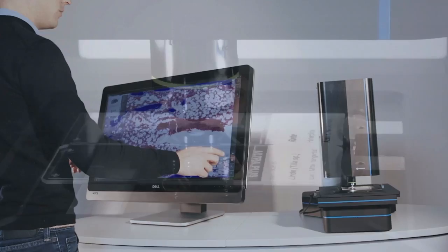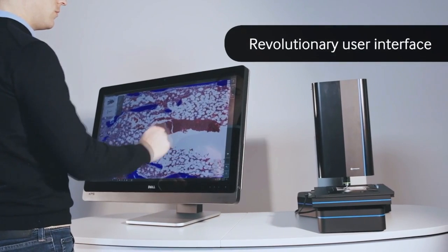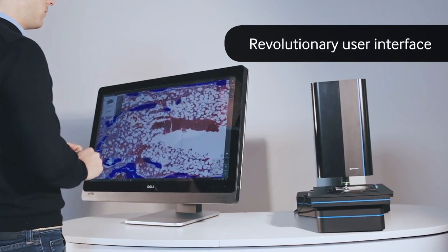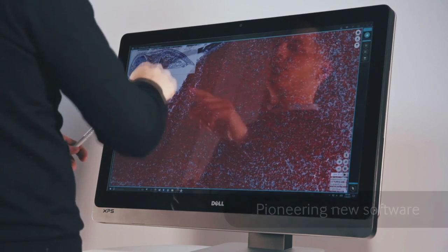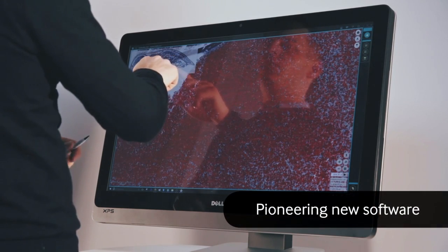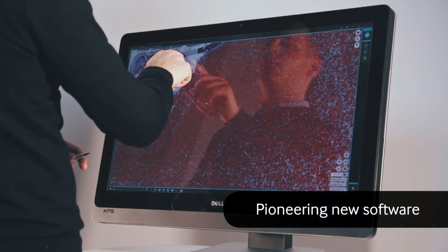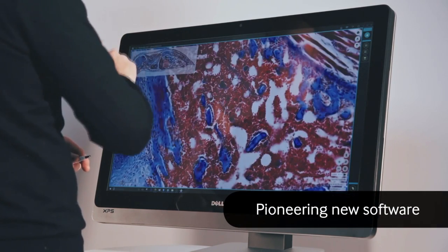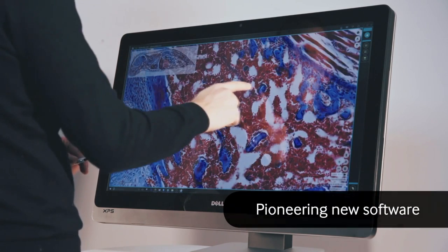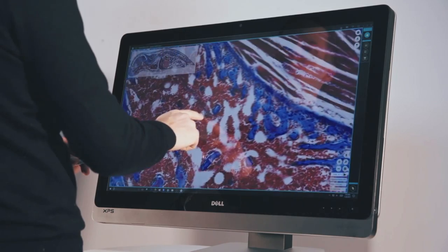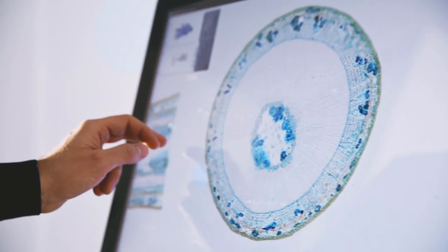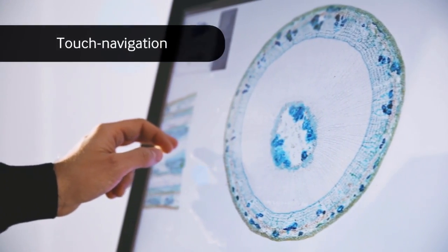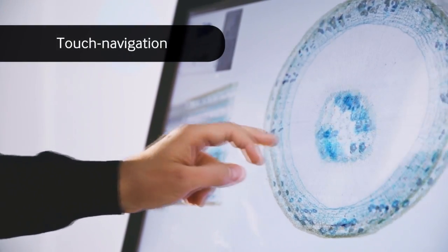A revolutionary user interface enables a revolutionary product. PresiPoint introduces an entirely new user interface based on large multi-touch display and easy-to-use software.